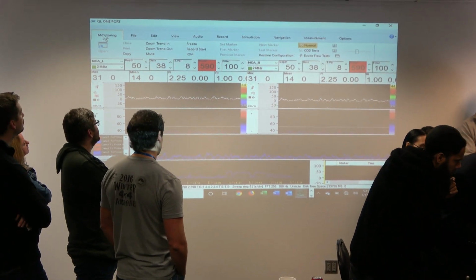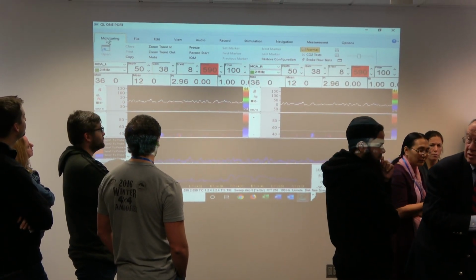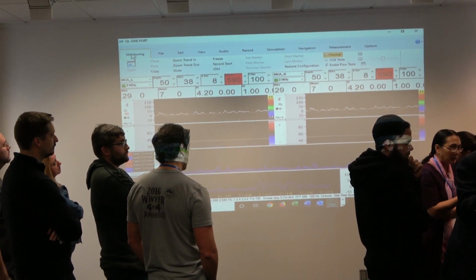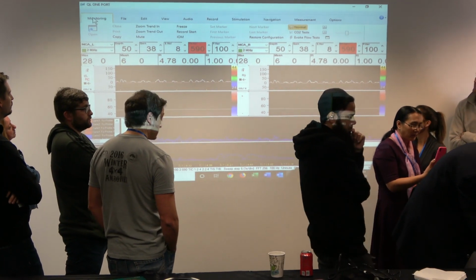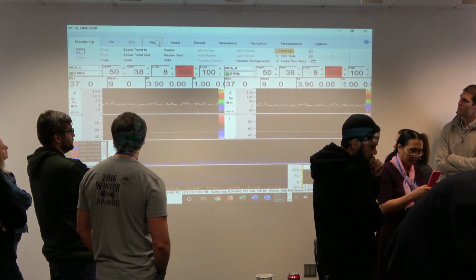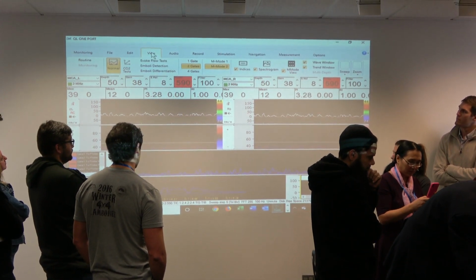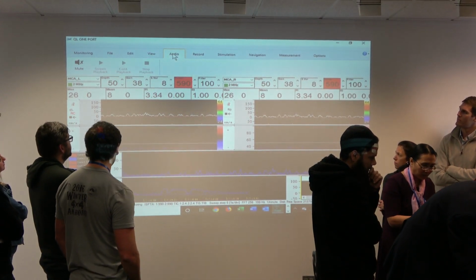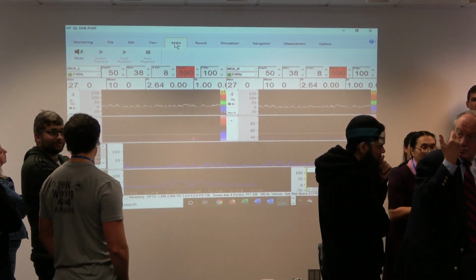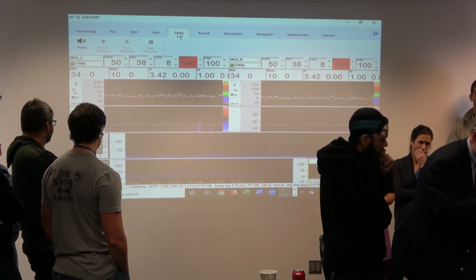Depth 50 millimeters, 5 centimeters, which corresponds to the middle segment of the M1 segment of the middle cerebral artery. It is very close to... Contralateral is much closer, a much more shallow depth.